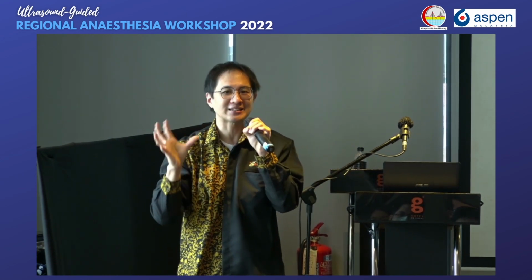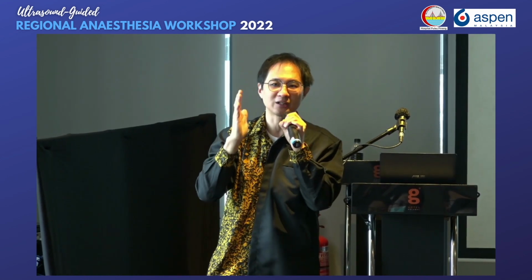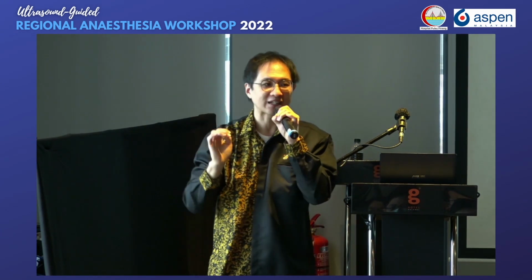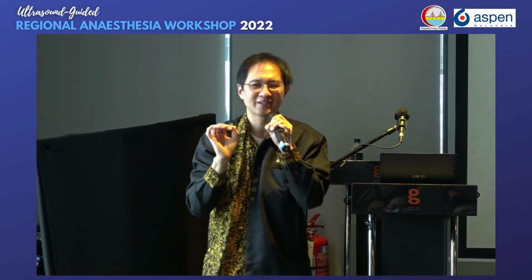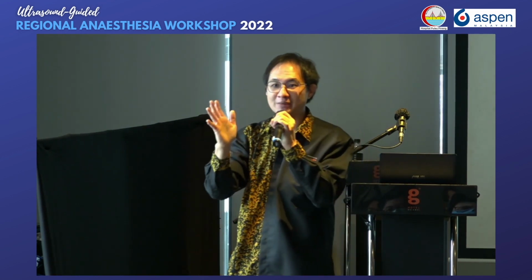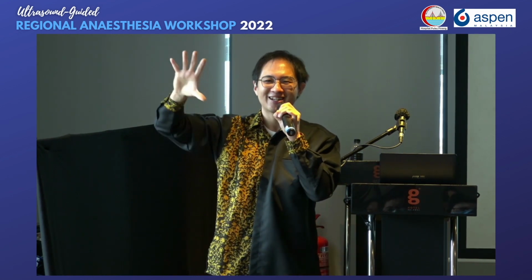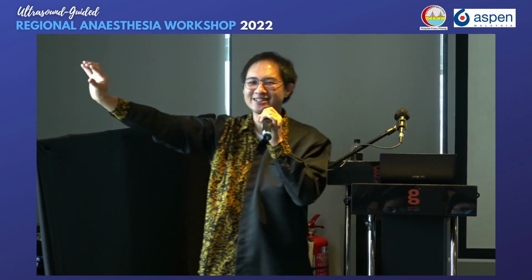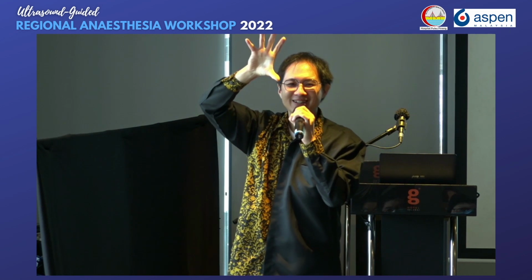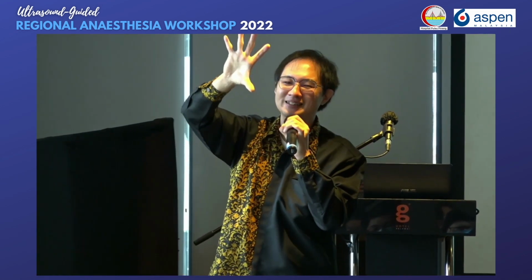Another technique that I might suggest is you try to scan the nerve just before it enters the gluteus maximus at the proximal thigh. That is another place where the nerve is actually not so deep. You know that the sciatic nerve lies behind the hamstring muscle, the biceps femoris. The muscle at the origin and insertion is very small, because it's tendon. At the middle, it's very big, so if you scan in the middle you definitely cannot see, because the space is very deep.